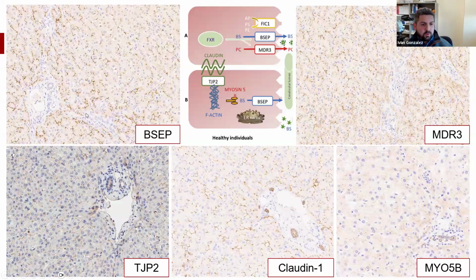And here are some control photographs of the immunohistochemistry markers that you can use, BSEP and MDR3. These immunohistochemistry markers are quite challenging to get to work, and we don't have them here at IU. If I have a case, I just send it to a reference lab. I suggest doing the same, sending it to a reference lab that has a lot of experience with these antibodies, because these are very rare cases and very tricky to make the antibody work perfectly.